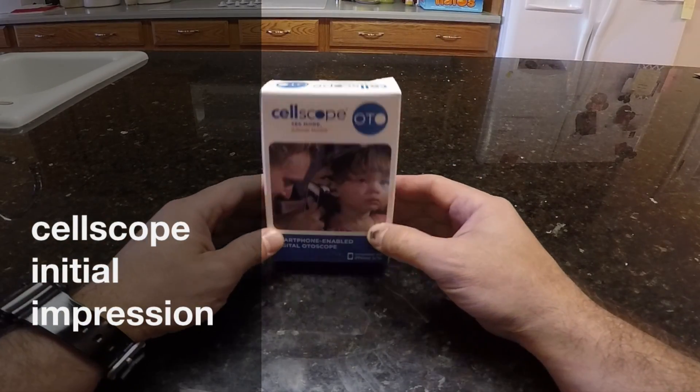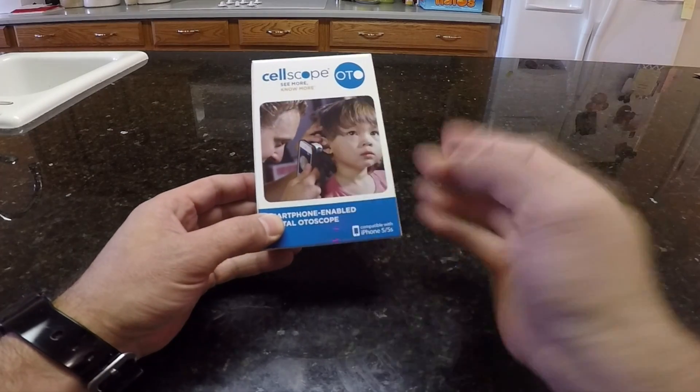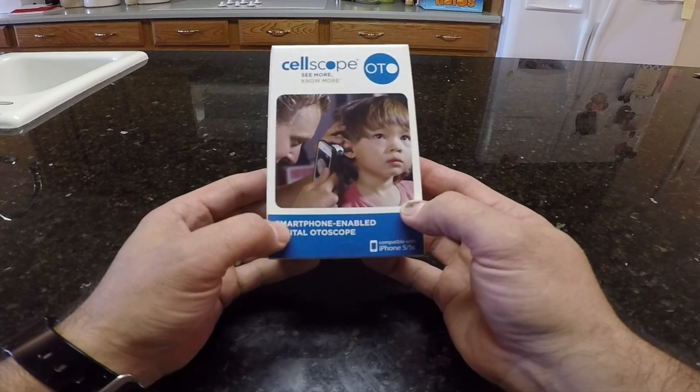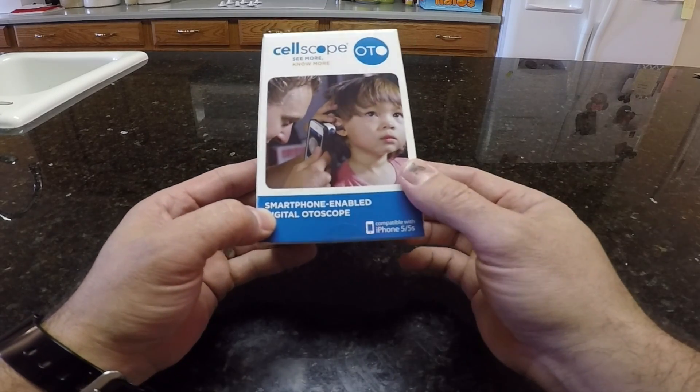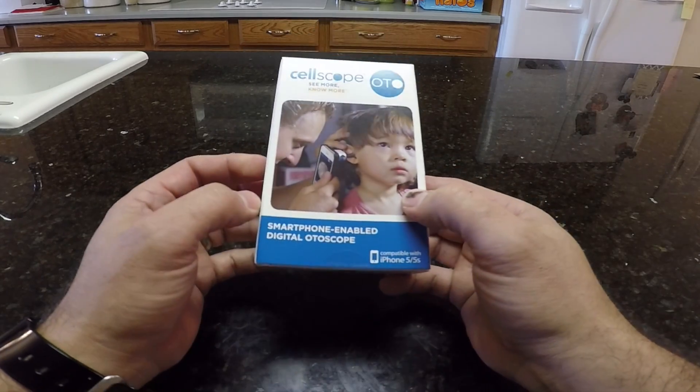Hello everybody, Dr. Carlo Ojeda. In this video we're going to be talking about the unboxing of this device called the CellScope. It was a device designed out of Georgia Tech. It's been out for about a year, mostly in trials, but finally available for purchase through the website.